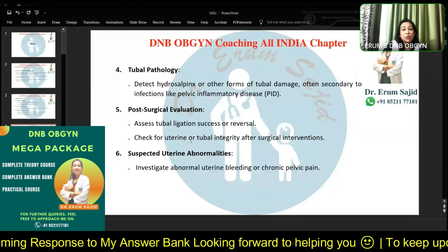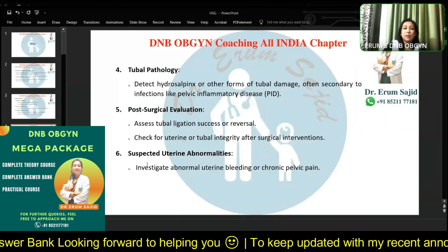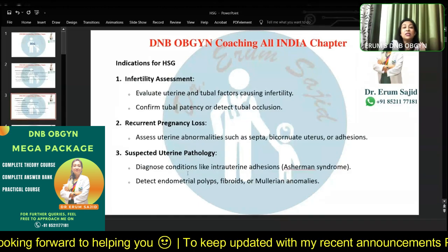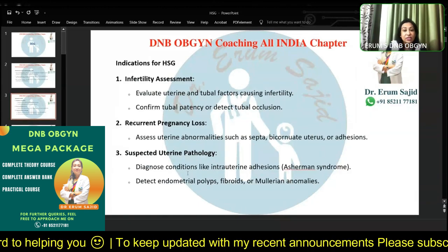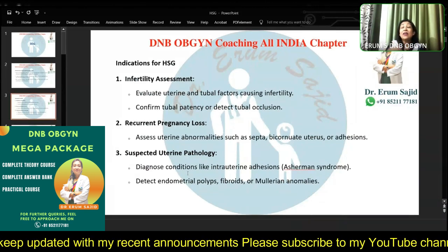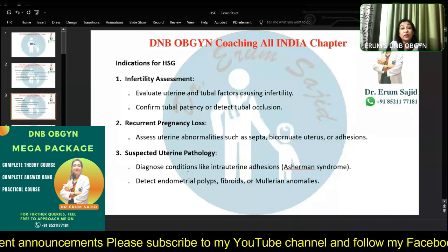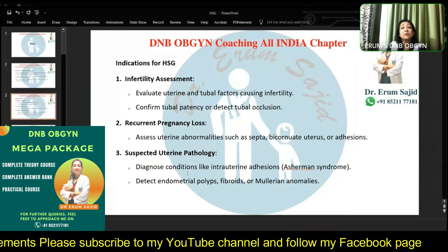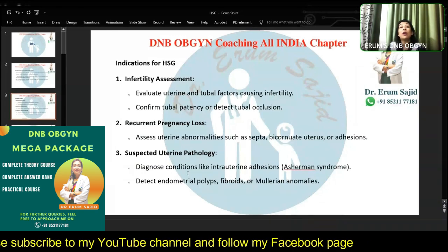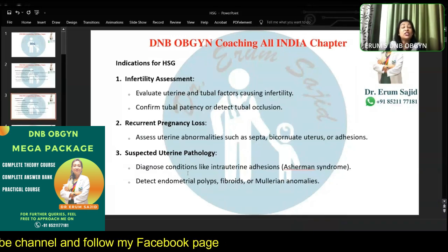And if you want to know certain uterine abnormalities, this last one I'll skip. Let's not include this. Let's just include the infertility assessments. You want to see the uterine cavity, you want to see the tubal patency, and if there is any tubal pathology like hydrosalpinx, salpingitis isthmica nodosa, that kind of a condition, or absent tubes, or very thinned out tubes, or just a tubal defect. Then recurrent pregnancy loss mostly will tell you about the uterine condition.